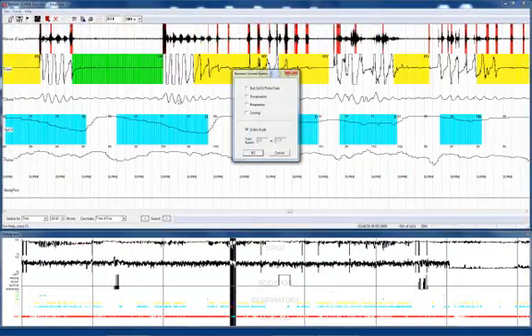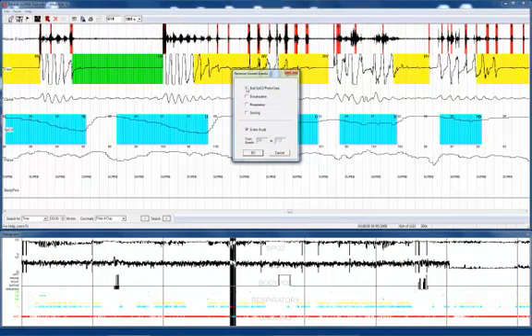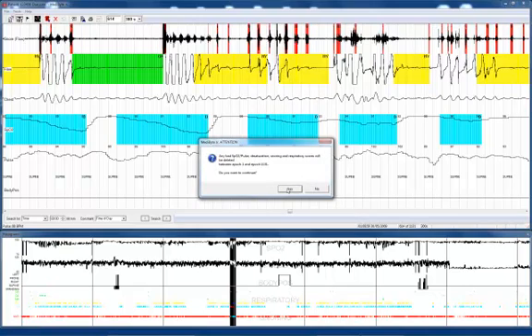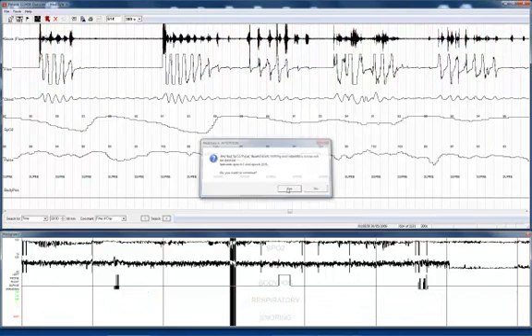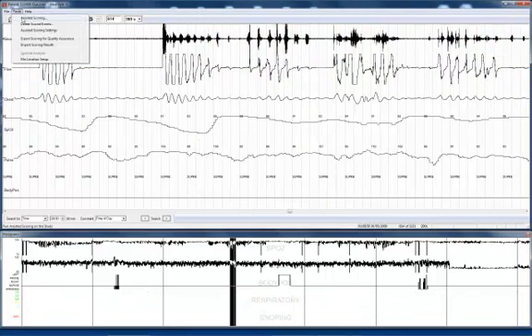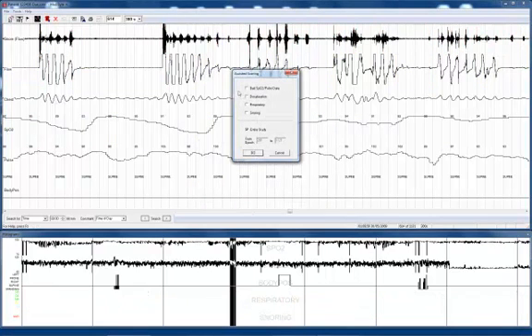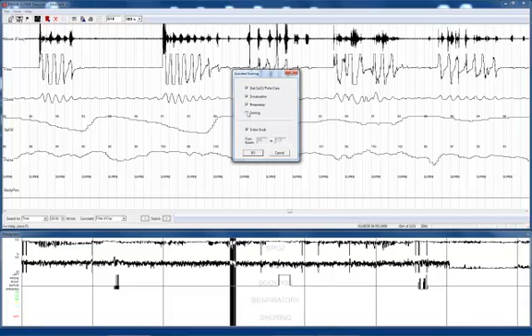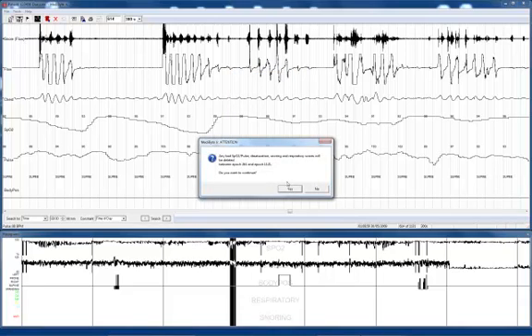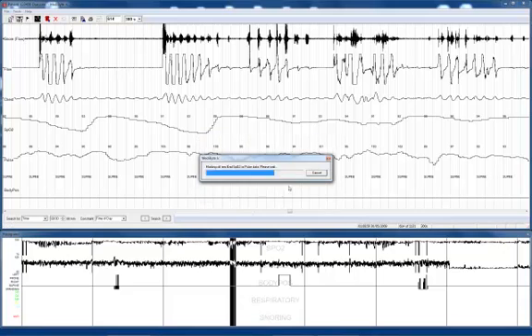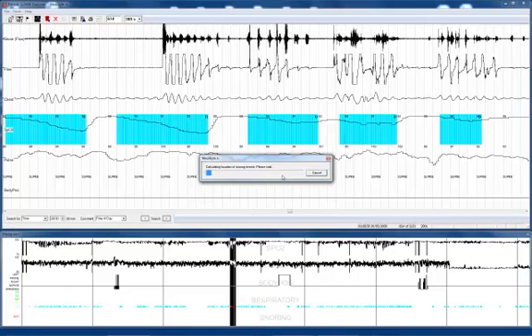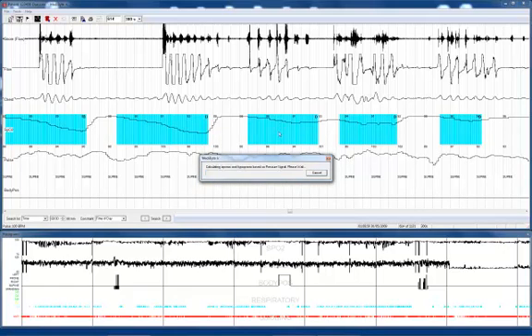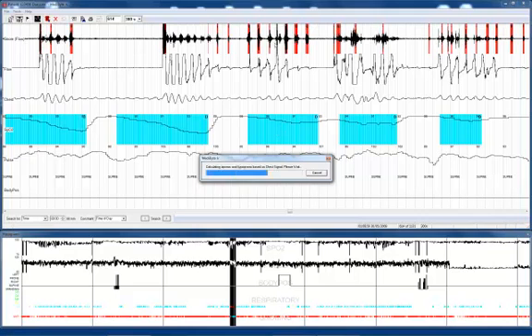The delete scoring events allows you to remove all of the computer-generated scored results. The assisted scoring selection allows you to reanalyze the data using the computer automatic analysis. The computer is now reanalyzing all of the data and laying down events on the screen.